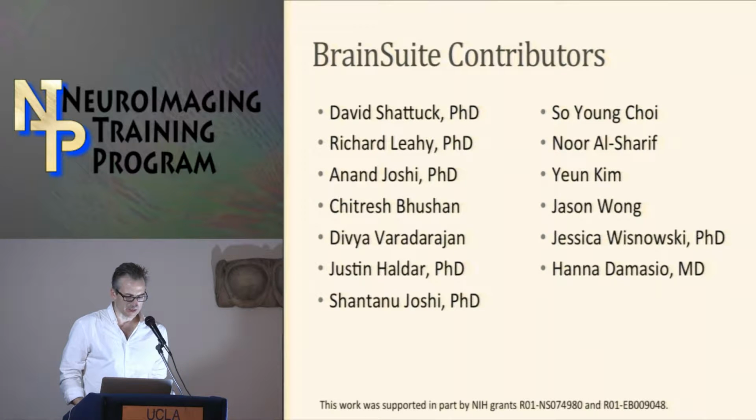This project started when I was a PhD student, and the first release was basically when I finished my PhD. I did that work with Richard Leahy, who I've continued to collaborate with ever since. We've continued to grow the software, and I want to acknowledge that this is the work of a great number of people who we've worked with and continue to work with. I've listed a few of them here.